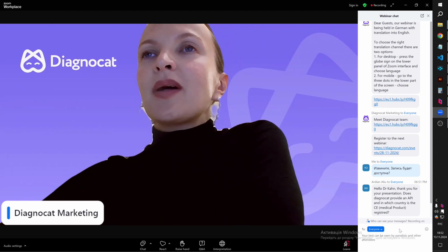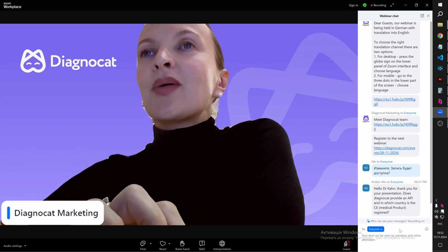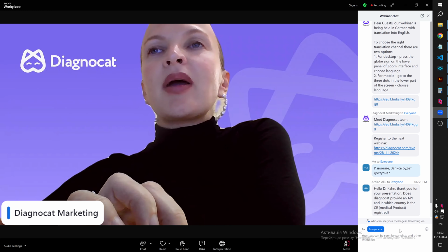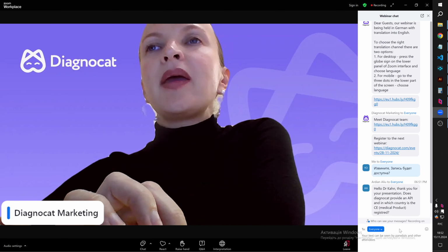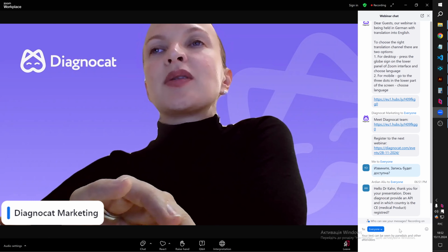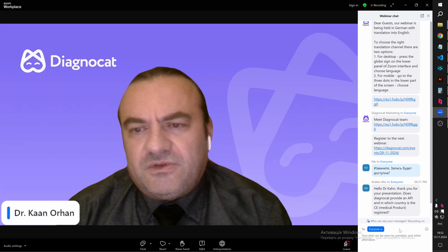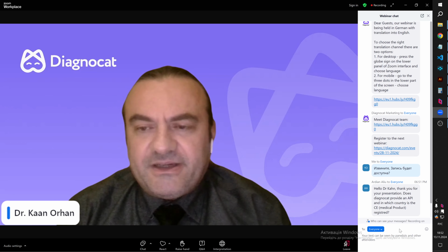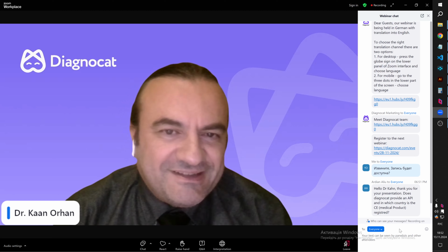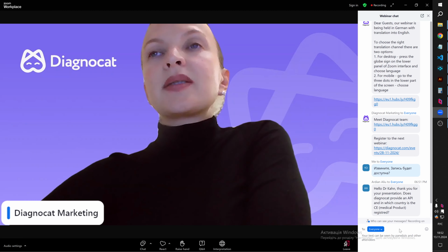So another question to you in our chat. Dr. Khan, thank you for your presentation. Does DiagnoCat provide an API, and in which country is the CE medical product registered? Well, actually, right now there's a wide range for the medical product registration, but perhaps Victoria can reply better than me about this. Yes, yes.